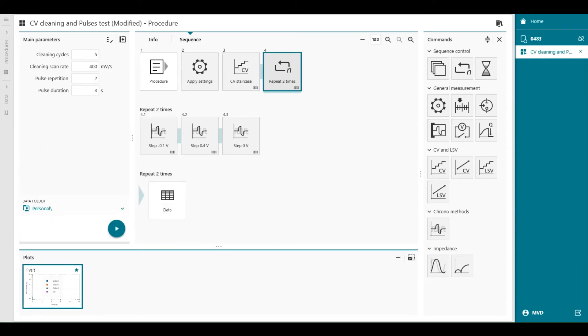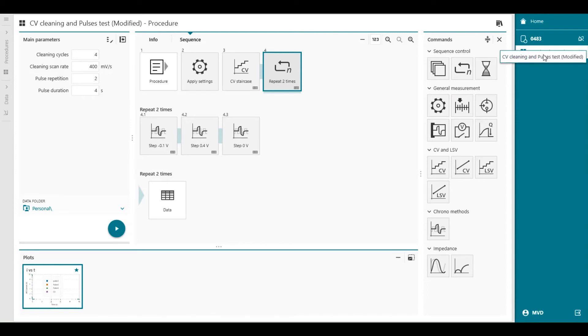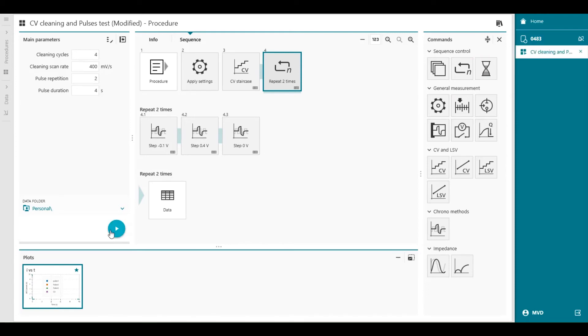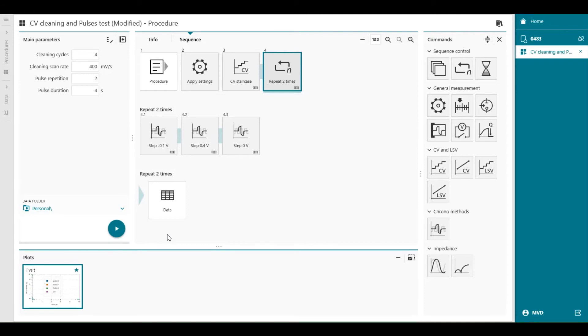Before we start, we can change the main parameters. For example, the cleaning cycles. We want to set to 4. Cleaning scan rate is 400 millivolt a second. That's okay. Number of pulses. Repetitions. Two times. And the duration of the pulse. Let's make it 4 seconds. Cleaning cycle is 4. And everything is accepted. You see that the procedure is underneath my Vionic. Which means we can start execute the procedure. It's going to be stored in my personal library of my data folder. You can modify this. Or browse to another library if you want. But when we press start.